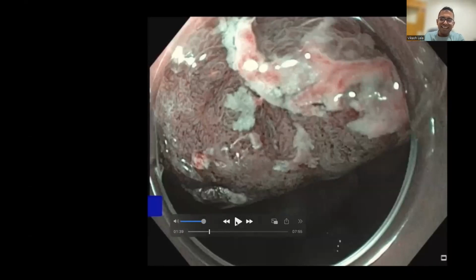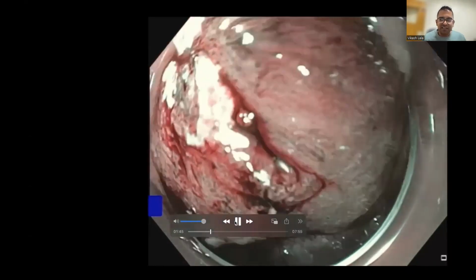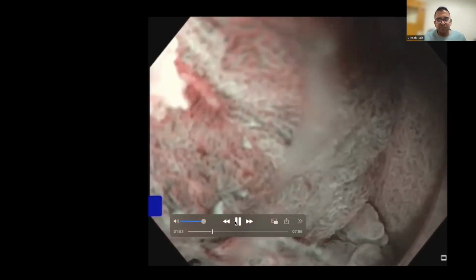I call it irregular with some maintained structure. Now, just be careful that you actually have to assess the whole nodule as well as the back end of the nodule, because just looking at one demarcated area doesn't mean there's another area that's completely irregular with loss of structure. And that would mean that there may be an area that's deeply invasive. So you have to assess the entire region.